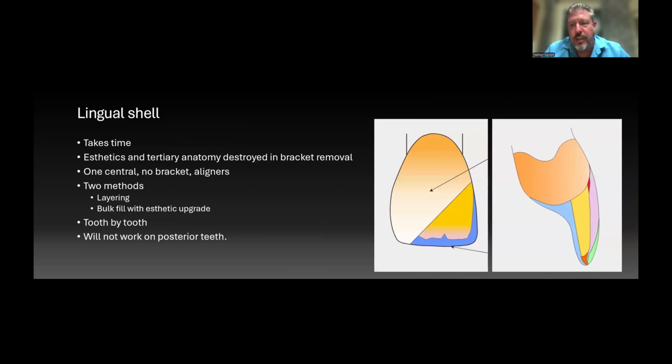So let's talk about the lingual shell. This is what you learned in school. It's the traditional clear palatal shell, layering in some mamelons, putting in your tints, putting a clear layer overhead. It takes a lot of time.